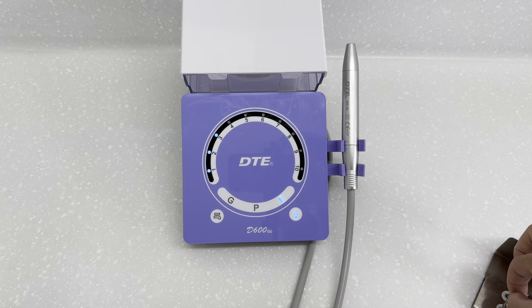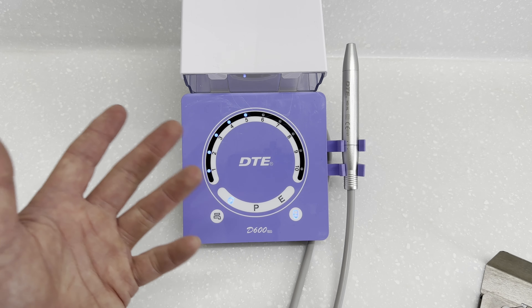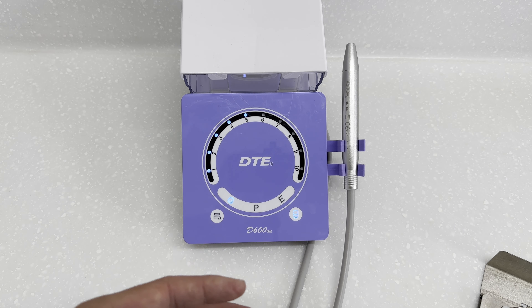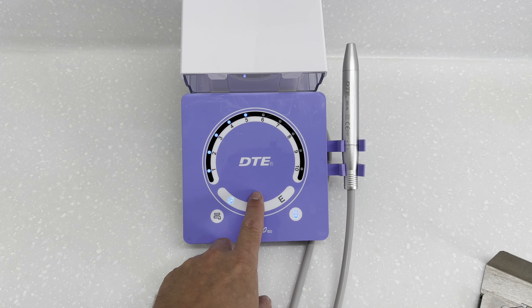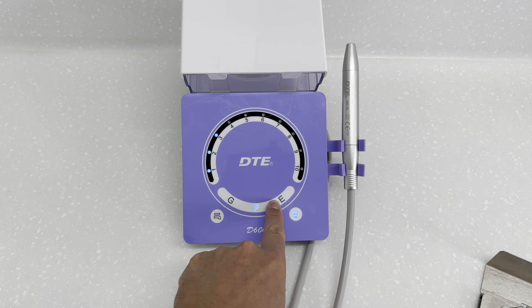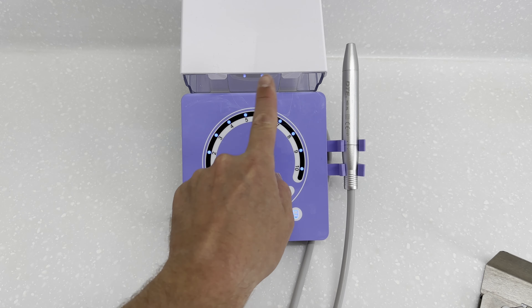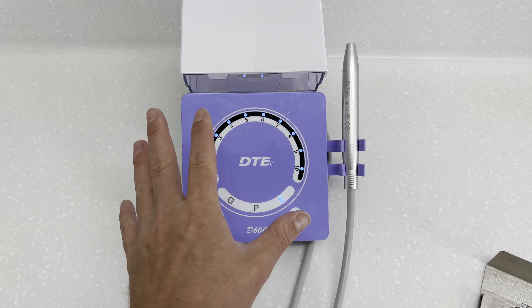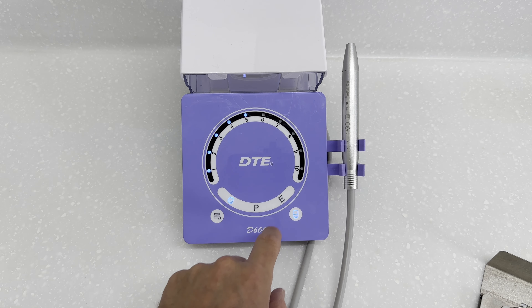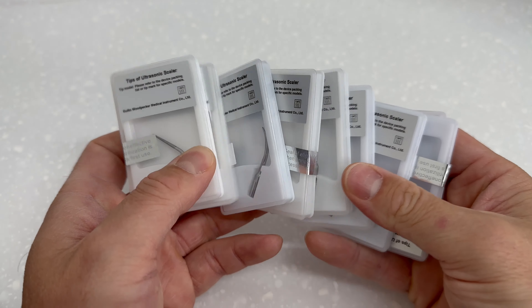Also take into consideration the mode buttons. G is for general use such as hand scaling with an ultrasonic scaler, P is for perio, and E is for endodontics specifically. You'll notice that intensity level 10 on the E setting is much less than intensity level 10 on the general purpose setting.